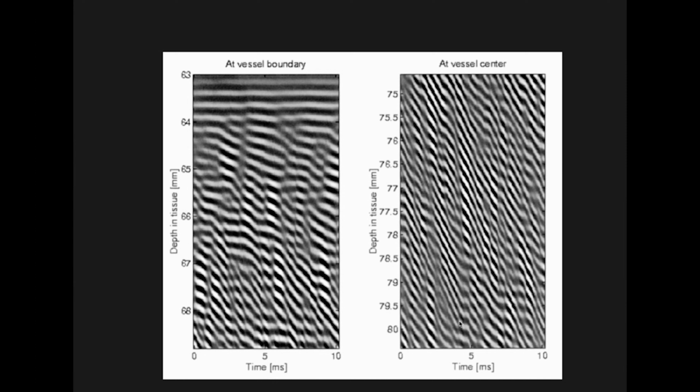And that's what we know when we think about physics again, we think about hemodynamics, we know that within a tube, the velocity will vary according to a parabolic profile. So at the vessel boundary, the blood is sticking to the vessel, and the highest velocity is in the center. And so that means that if you send out ultrasound reflections in the same direction as a function of time, the reflection that you receive will change more, depending on the local velocity of the blood.